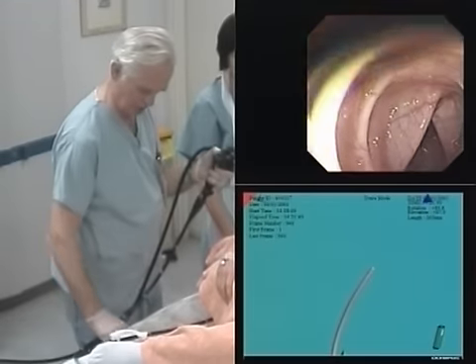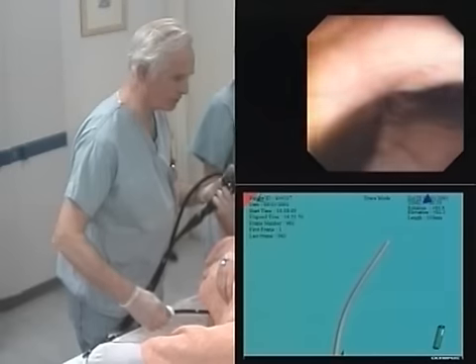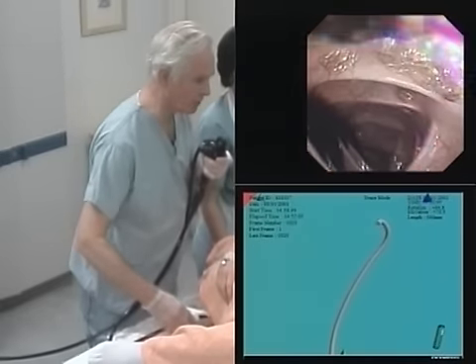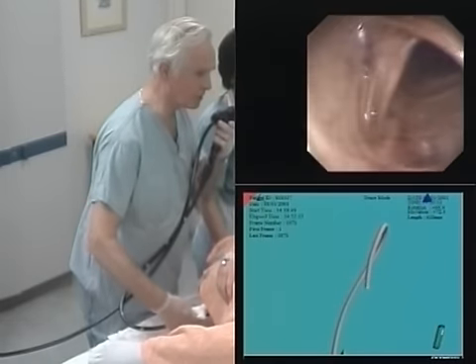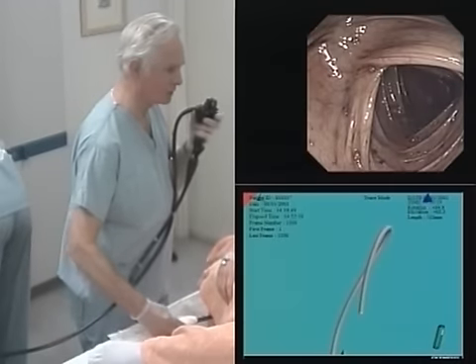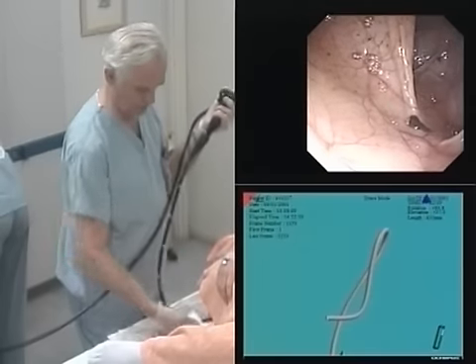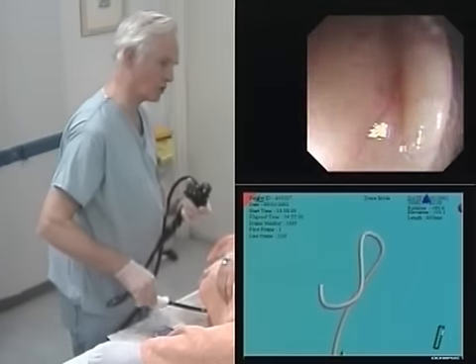I'm now going to stiffen the scope and let us see how that goes. That's going pretty well — it's advancing, that's good. We've done the bad bit. We're going across into proximal transverse. So there wasn't very elegant, the first part, but a moment to push — there's a very deep loop here, but it's going well. I think what I'll do at this stage is unstiffen the scope again, and it looks as though this could be coming to transverse — to hepatic rather. So I'll pull back.